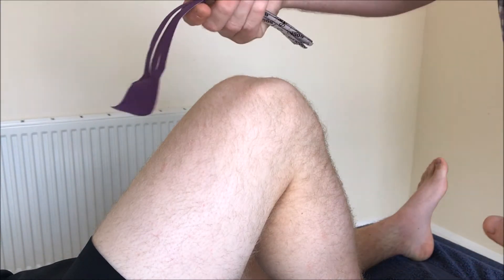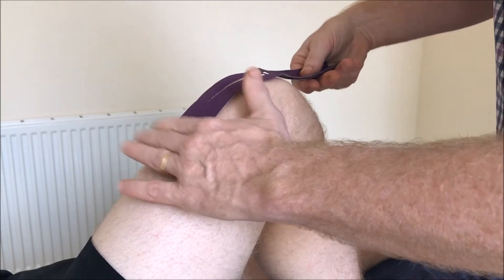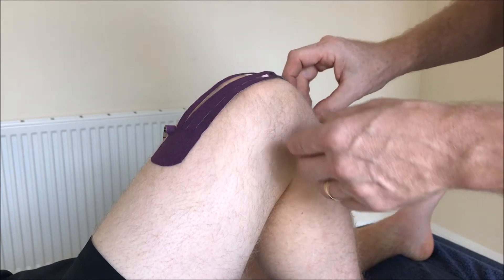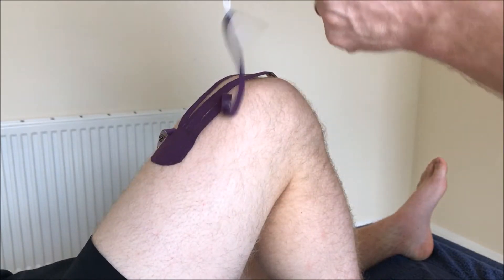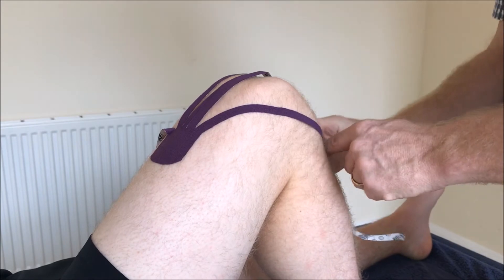We'll place a fan at the middle of the thigh here. This has got five tails — one, two, three, four, five — and then we'll distribute each tail around the front of the joint. We'll start to take the backing paper off here, and bring each tail around with a slight stretch and around the front.